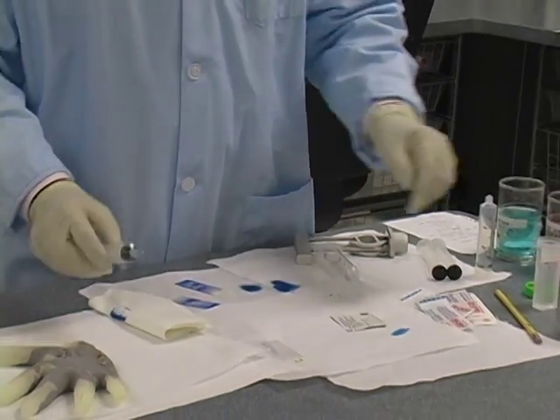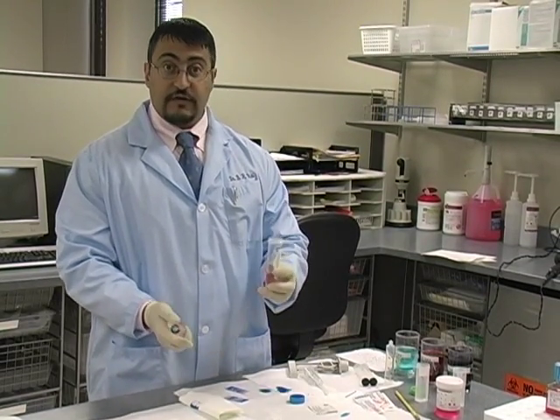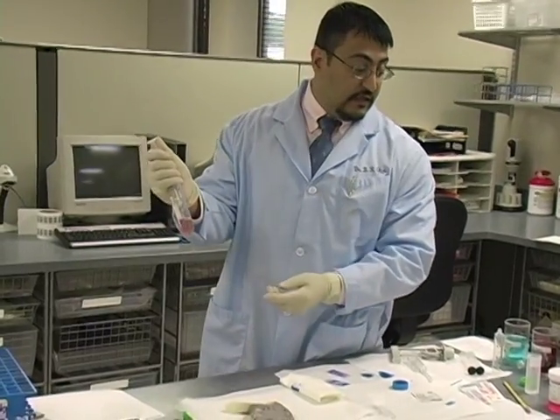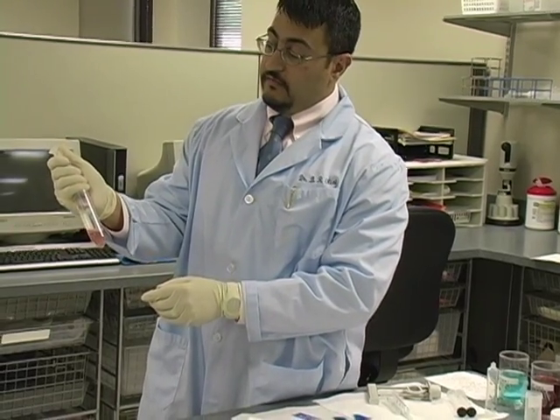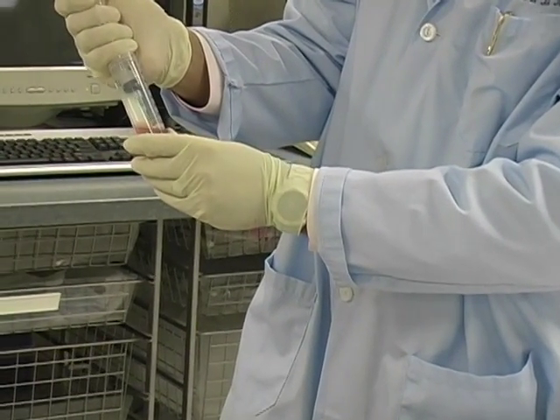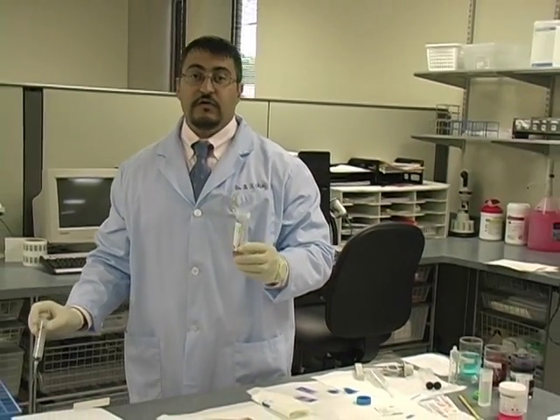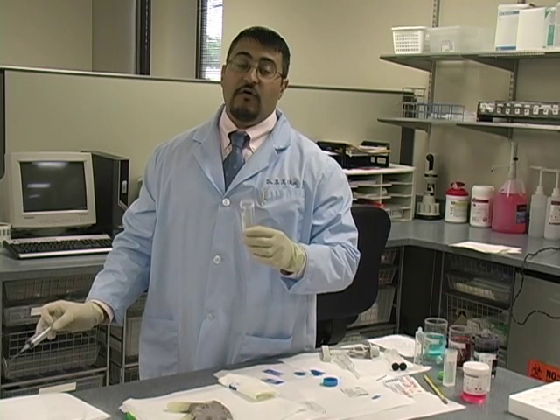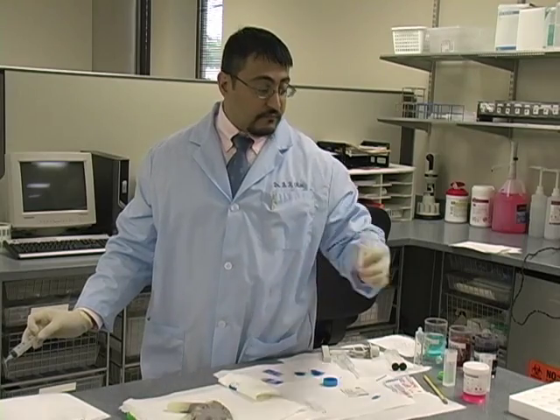If this was a lymph node and I was worried about a lymphoproliferative disorder, instead of rinsing in the cytolight, I can rinse in RPMI — same technique, I just put the needle in RPMI instead of cyto rich red. I allow some RPMI to percolate through the needle and syringe, then let the material out. You'd be surprised how many cells will be in there. To do a good flow cytometric analysis with a full panel, you generally need about a million cells. So when I'm worried about a lymphoproliferative disorder, I'll do one or two whole passes where I just rinse into RPMI to get a good specimen for flow.